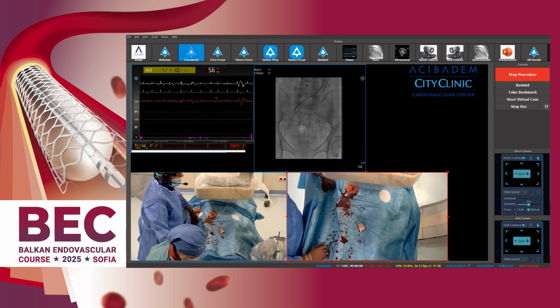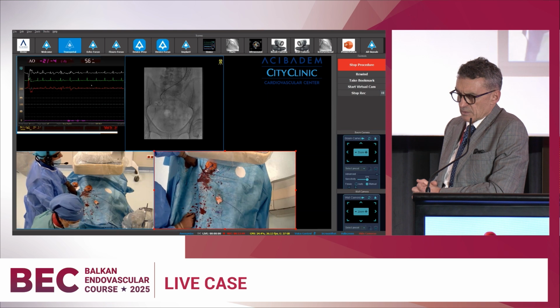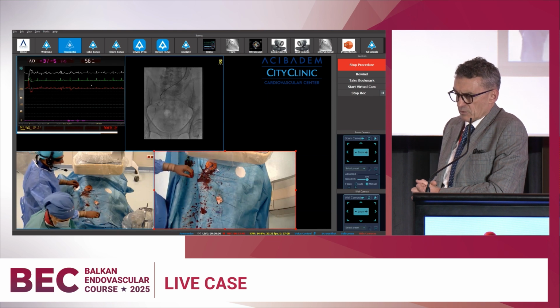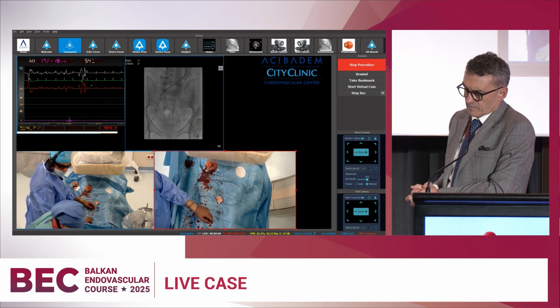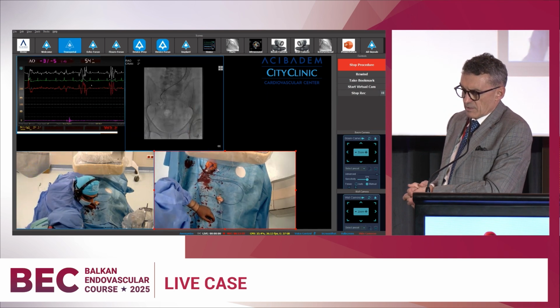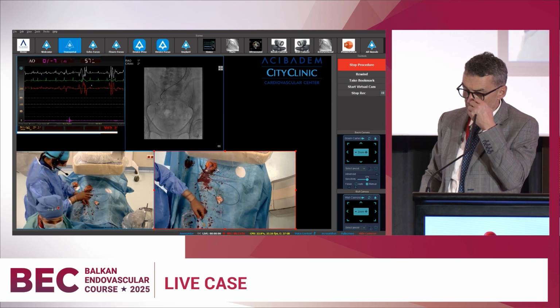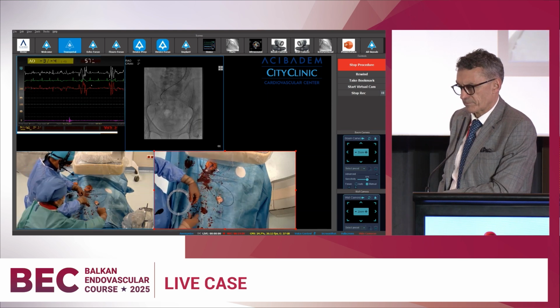So what we see now, I'm asking you, is this the wire from above, from the brachial approach? Yes, and catheter from the femoral approach. Okay, and I'm waiting for the lasso. Yes, and it's a very interesting thing. You can explain, Professor Petrov. We do not use the catheter from the lasso.